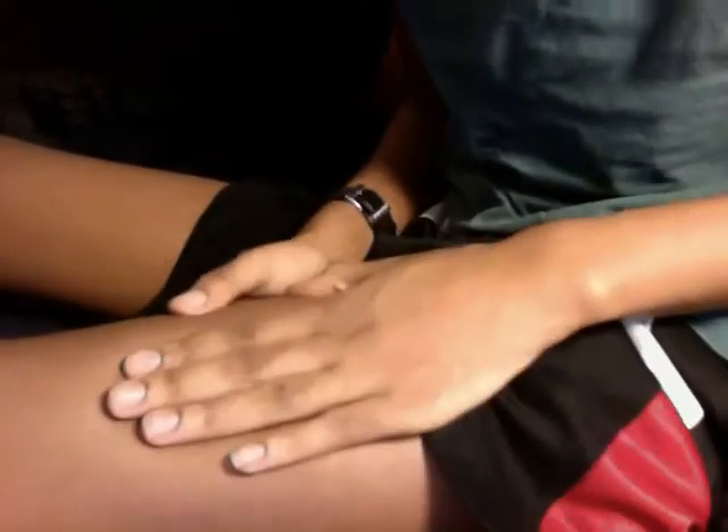Pull out, recap my needle, put it in my sharps kit. Now I'm going to rub my leg to move the T around. The reason I leave the needle in for a second is so the T gets drawn into the muscle so that when I pull it out it's not leaking back out. I'm rubbing just to move that T around in the muscle so it's not all sitting right where I injected it.